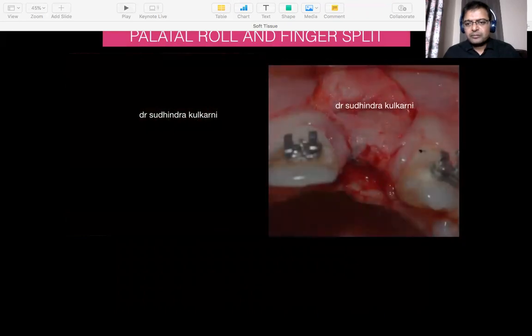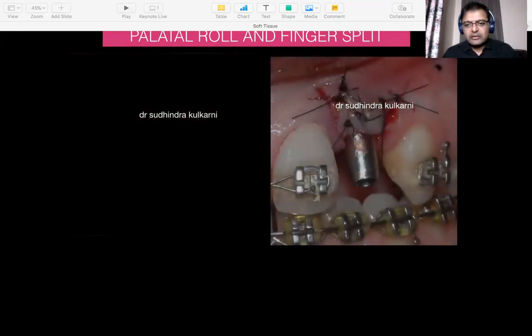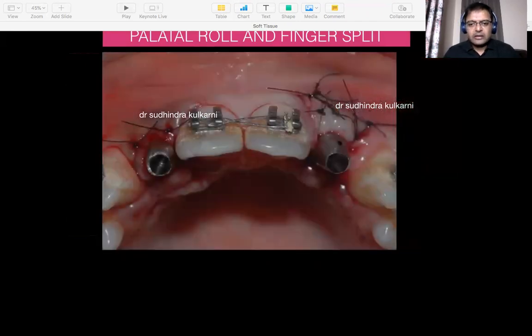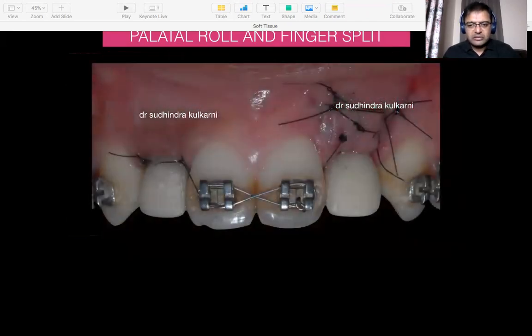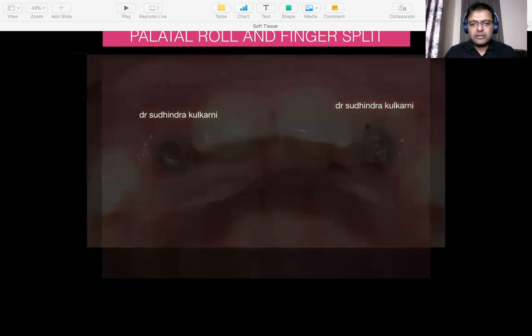Yeah. After the deepithelialization, it is now rolled in and then sutured up. And along with that, the temporaries are inserted on the same day. So what happens is the temporary then supports the overlying soft tissue. And 10 days down the line, when the patient comes for suture removal, you see that the tissue is good. Over the next month, month and a half, you see that the tissue would start shrinking down and then conforming well. And as this happens, we keep on shaping the temporaries.